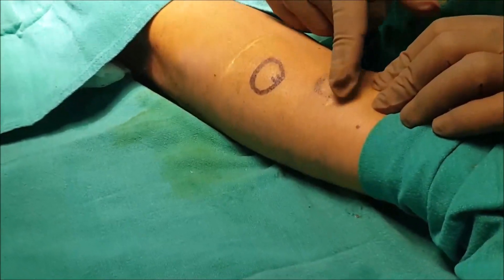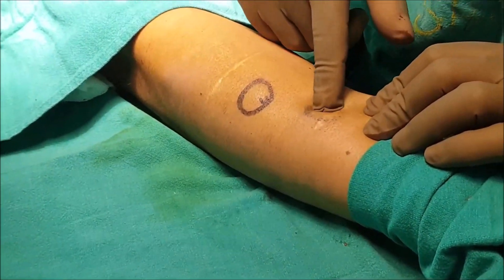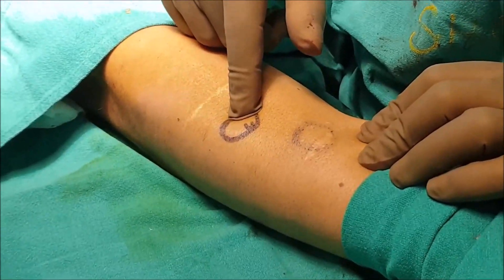This one was removed previously, and this one was also removed previously. Another one we are going to remove now, and this one we are also going to remove.